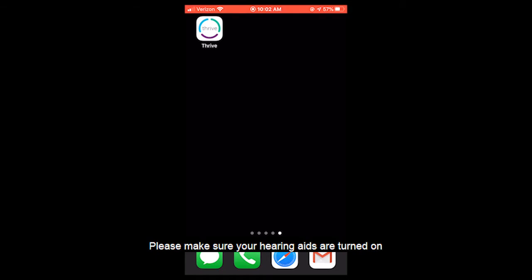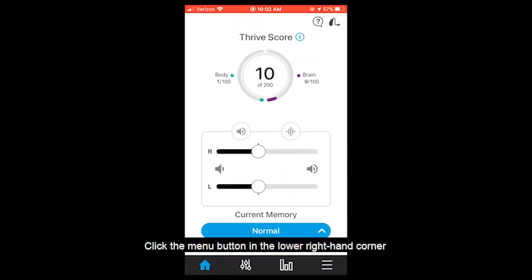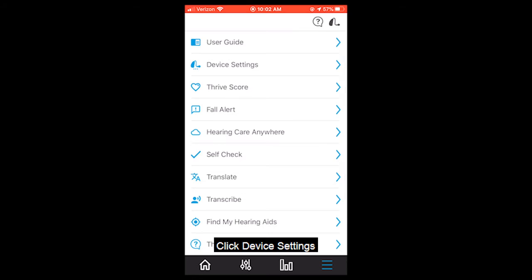Please make sure your hearing aids are turned on and connected to the Bluetooth on your phone. Then open up the Thrive app. Click the menu button in the lower right hand corner. Click device settings.